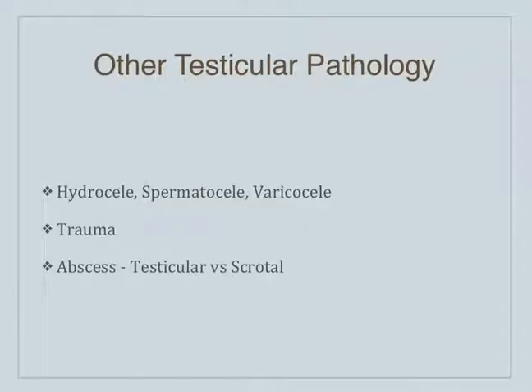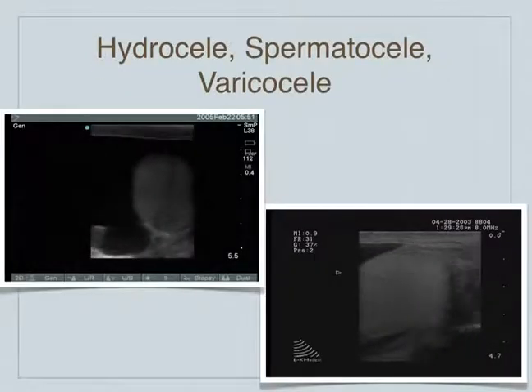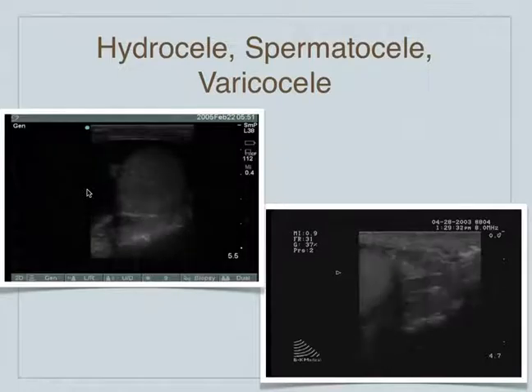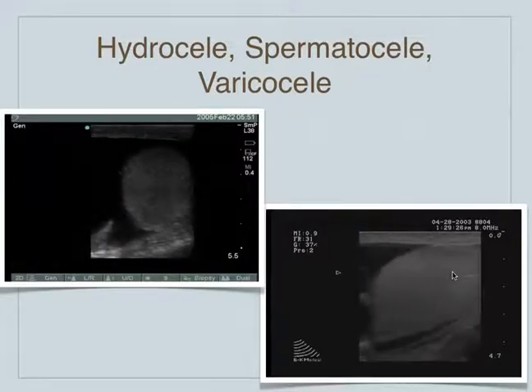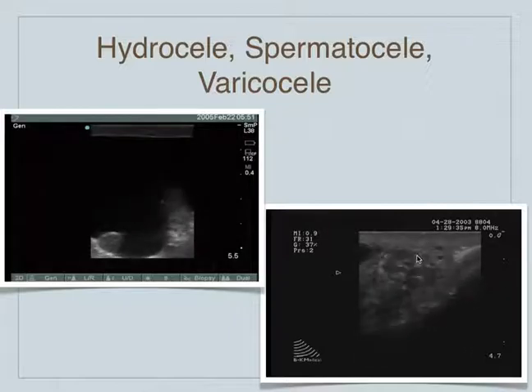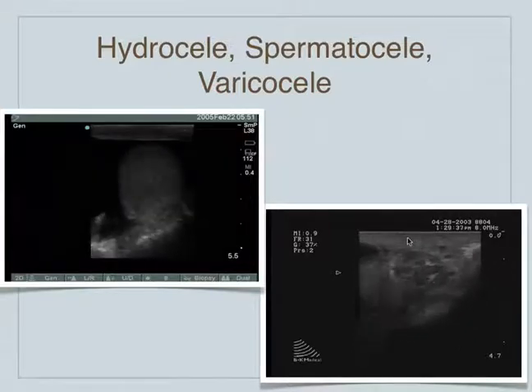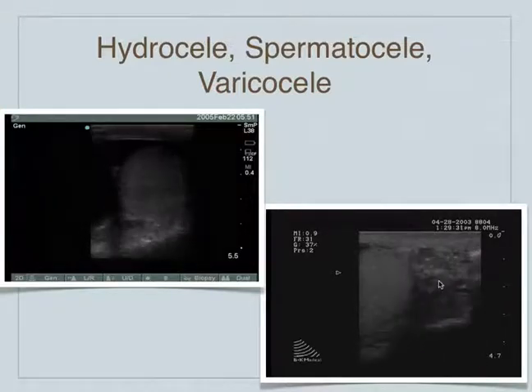What are some other pathologies we can see with the testicle? We can see hydroceles — basically fluid around the testicle. We can see spermatoceles and varicoceles. We can see evidence of trauma, like a testicular fracture. We can see abscesses within the testicle or the scrotum. This is fluid seen around this testicle here — what we call a hydrocele. A varicocele is when you've got basically a dilation of the venous plexus — it just looks like a bunch of tubes with blood in it. That's the pampiniform complex, I believe.